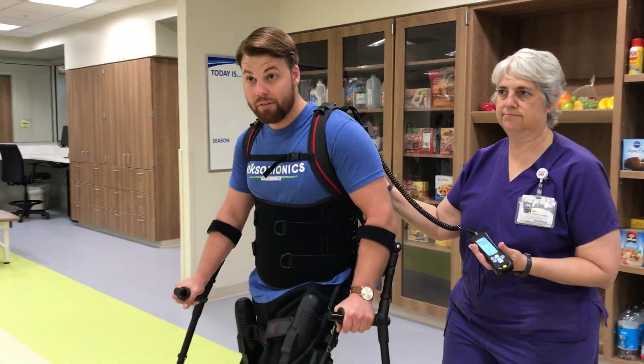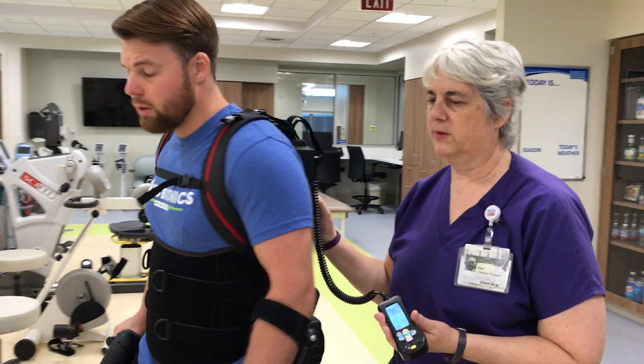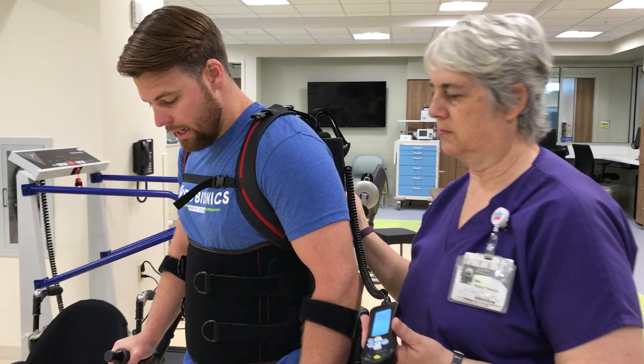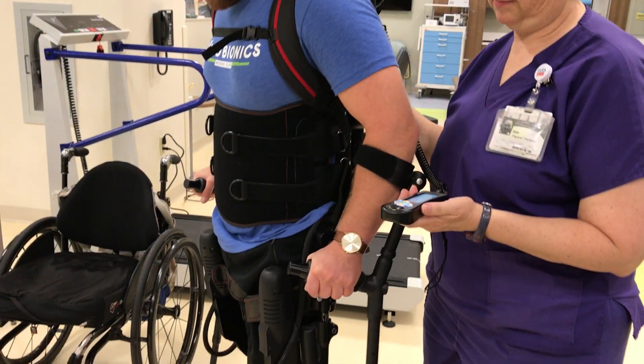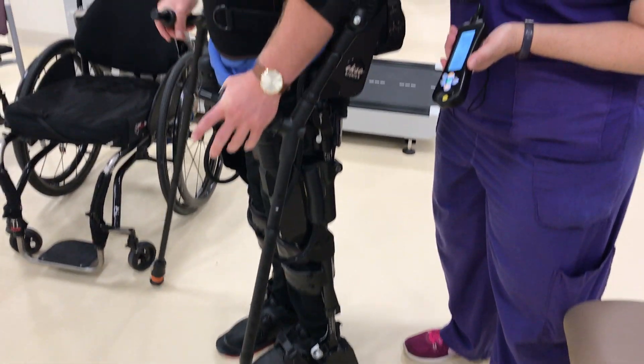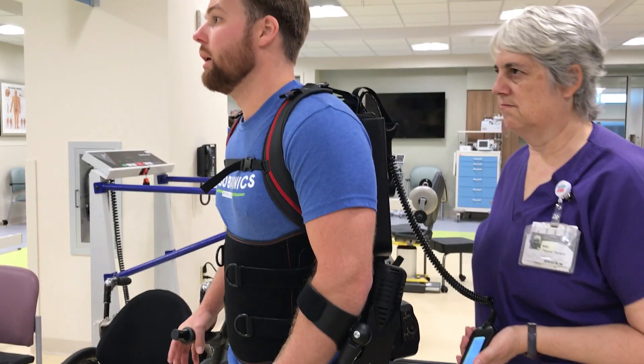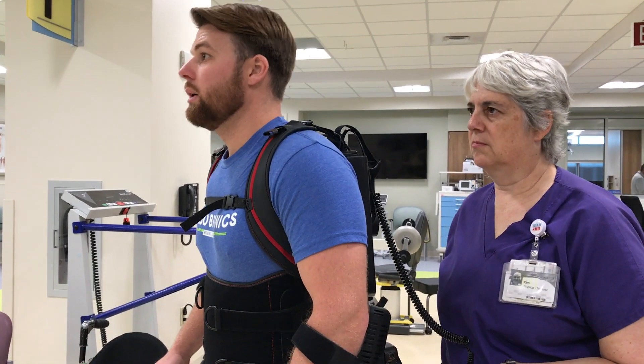I got injured about four, four and a half years ago in a car accident, and I was able to get into this device and work on building from the muscle that I have. I've seen huge improvements — I can walk in long leg braces with a walker, but that's not really efficient.